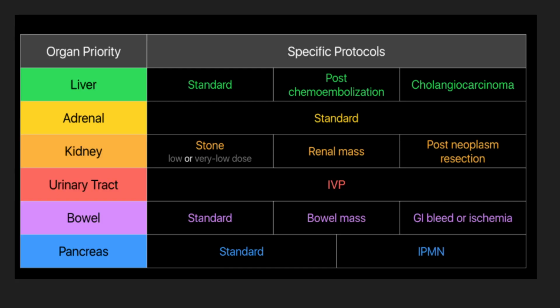And of course, now we're going to look at examples of the protocols for the remainder of this presentation. Obviously, the way it works in hospitals, you have a protocol and you order it. Some hospitals have you order the protocol via a Google form. Some hospitals have a PACS system. You can fill out the protocol and send it to the technologist. Regardless of whichever pathway, it's all the same.